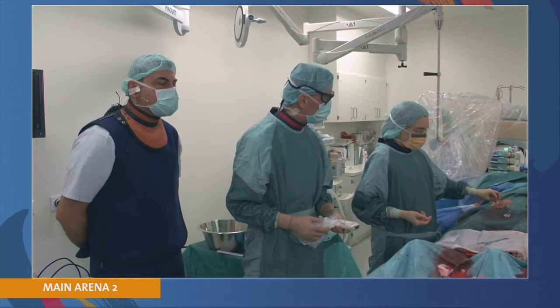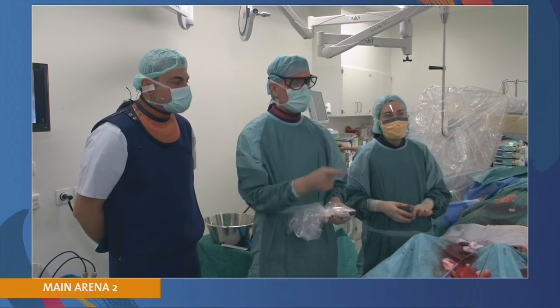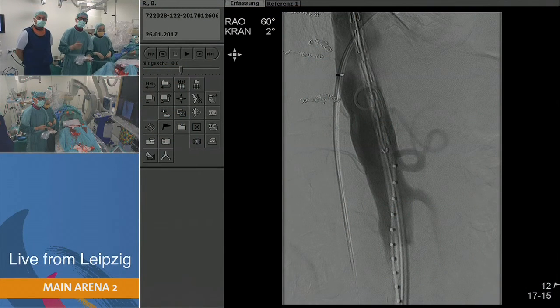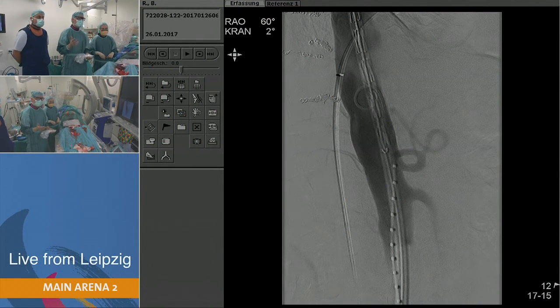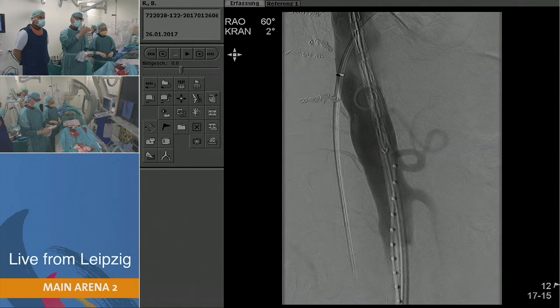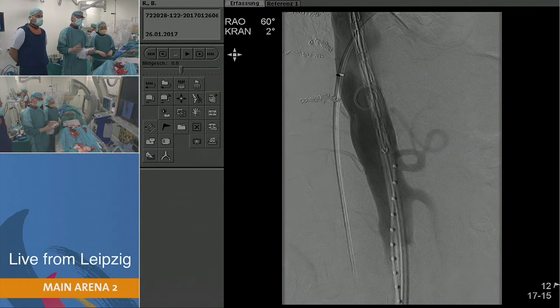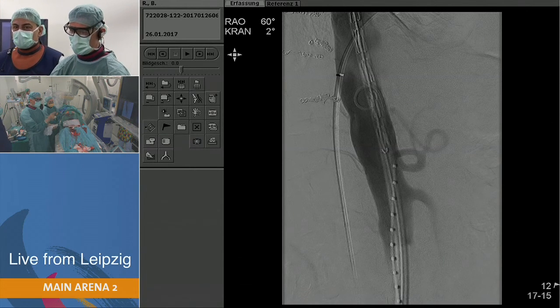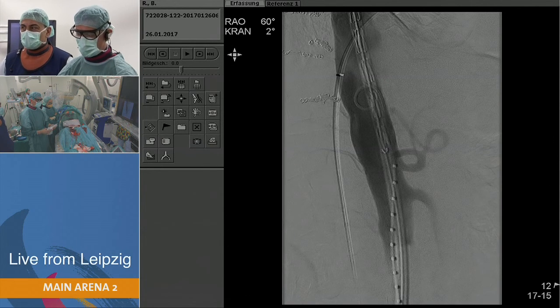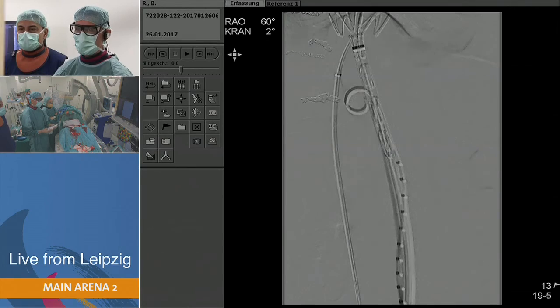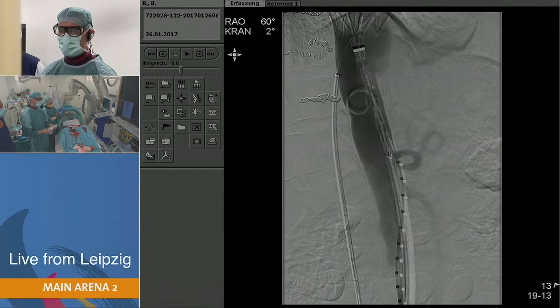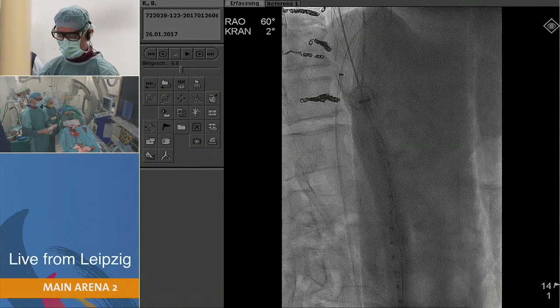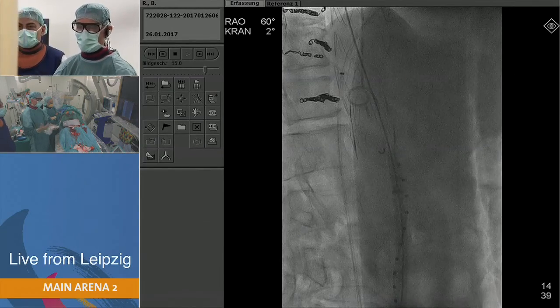We have completed the case. Looking at the angio after the first deployment — this second device is a 32-by-32-200 mm graft. We did a right oblique view to see the celiac trunk. We had one to two centimeters to land down to the celiac trunk. To be very precise, we used a recurved catheter into the trunk, and then did a shot over the pigtail catheter. You can see the graft is nearly completely open, and then we deployed the full graft.